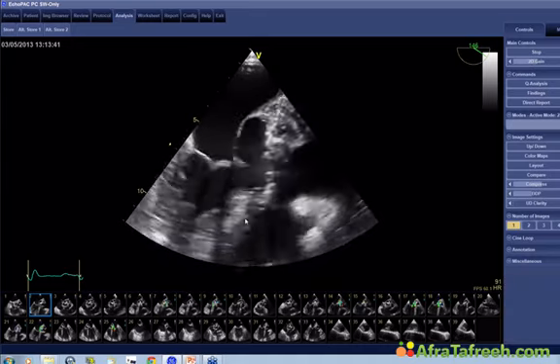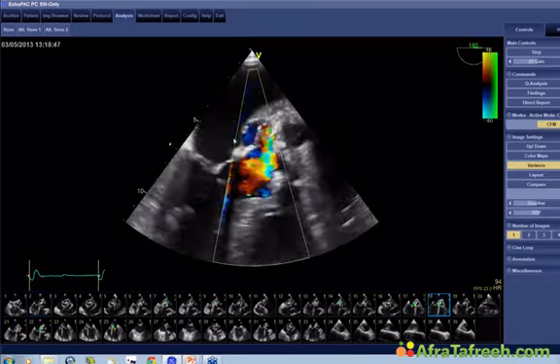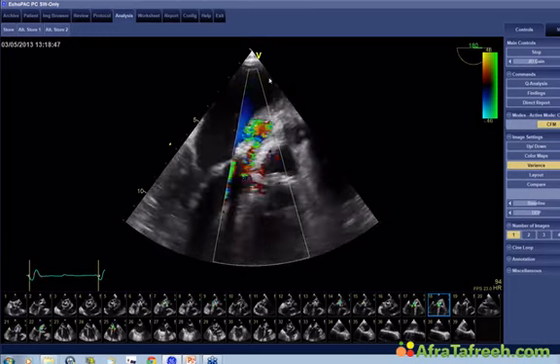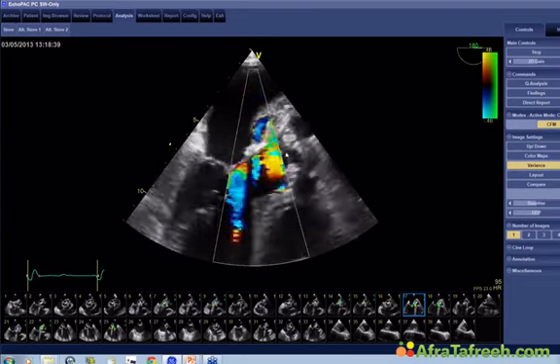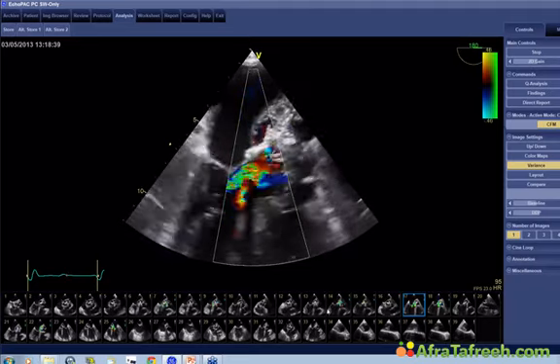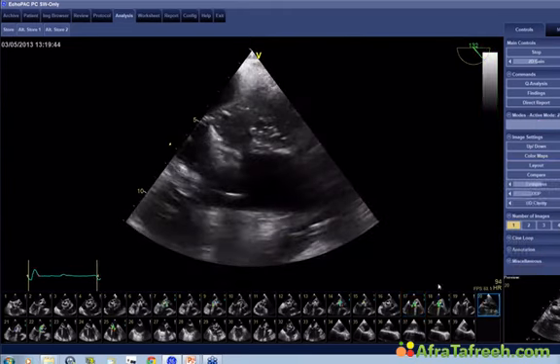This is a peri-aortic abscess, which is now turning into a pseudoaneurysm of the intervalvular fibrosa. Look at the flow. You see the flow going into this pseudoaneurysm and back again. It goes back and forth. And astonishingly, there is not much aortic regurgitation. Well, there is maybe moderate aortic regurgitation, but it's not as severe as one would actually think it is based on the severity of the aortic endocarditis.